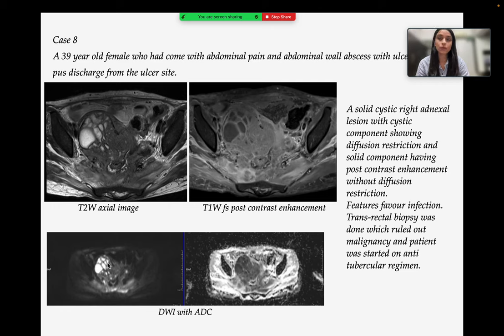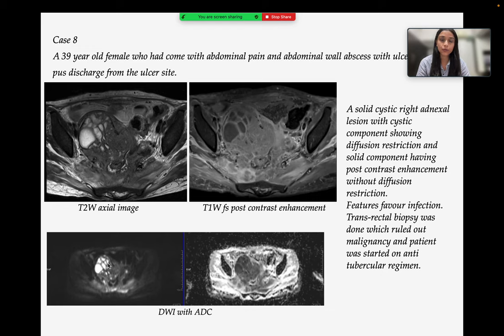Case 8 is a 39-year-old female who presented with abdominal pain and abdominal wall abscess with ulcer and pus discharge from the ulcer site. Images show a solid cystic right adnexal lesion with the cystic component showing central diffusion restriction and the solid component having post-contrast enhancement without diffusion restriction, favoring infection. Transrectal biopsy was later done which ruled out malignancy, and the patient was eventually started on an anti-tubercular regimen.